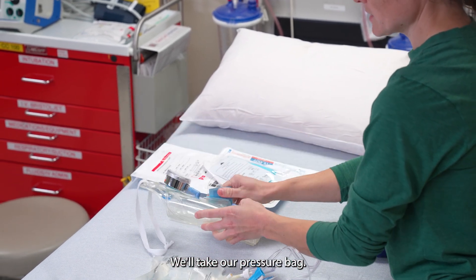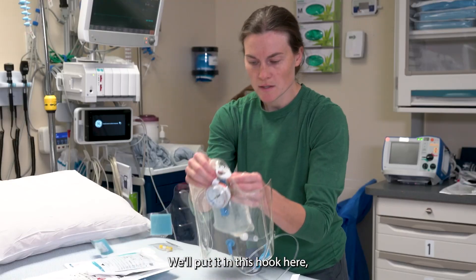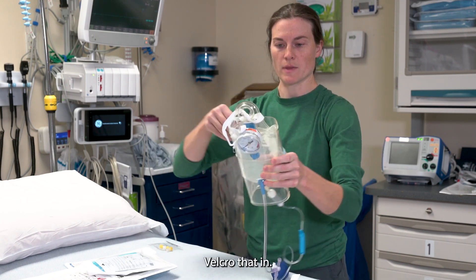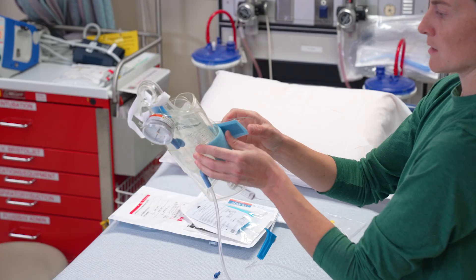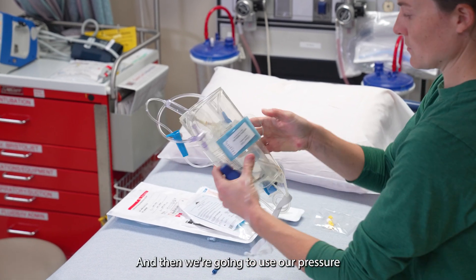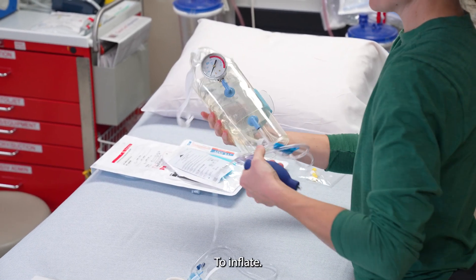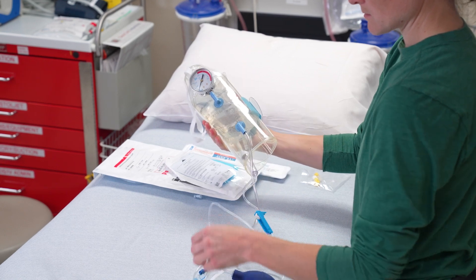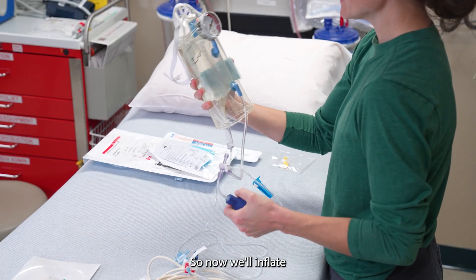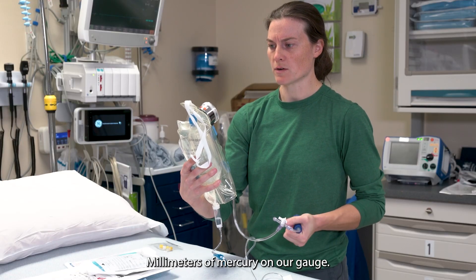We'll take our pressure bag, put it in this hook here, and then Velcro that in. The next thing we're going to do is invert, and then we're going to use our pressure gauge here to inflate. We'll inflate and go up to just a little bit over 300 millimeters of mercury on our gauge.